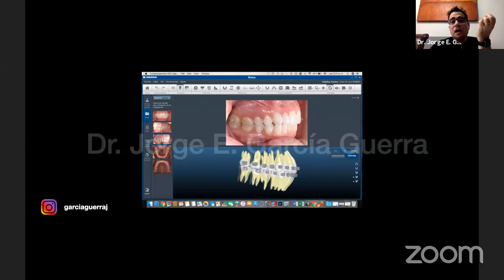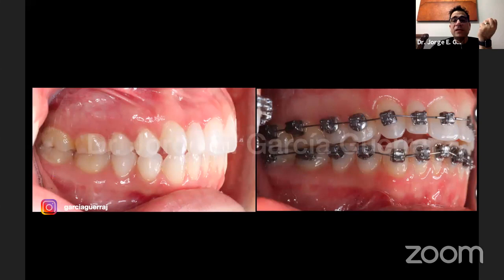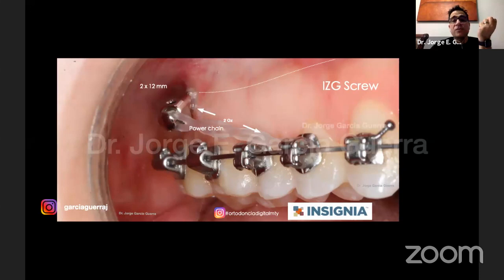And now this is the patient at the beginning. And this is when we put the brackets on. You can see that they're self-ligating. In this case, we put this mini screw in the mucogingival junction. You can see that, and we're using a power chain with a very soft force, 2 ounces, to the first bicuspid, so we can start doing the retraction. She also used some class 2 elastics that helped us with this correction.